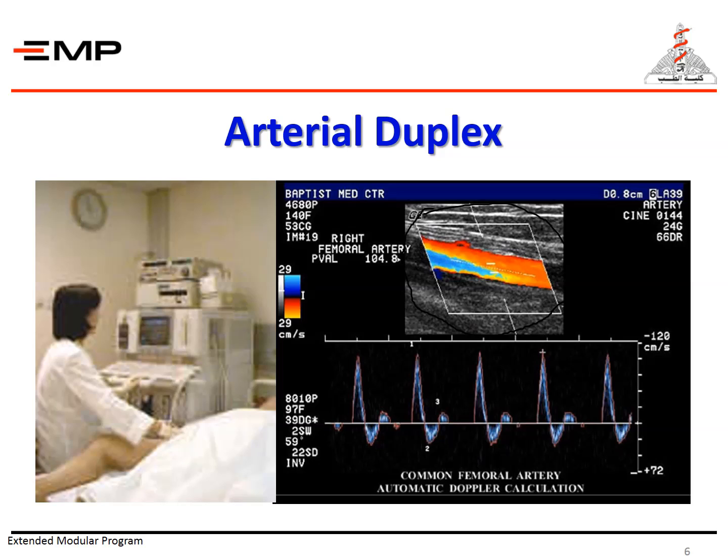Then, in its Doppler mode, it can show the flow within the selected artery. In the face-to-face session, the normal arterial waveform shown in the picture will be simply explained, as well as the significance of the colors seen within the flow of blood in the lumen.